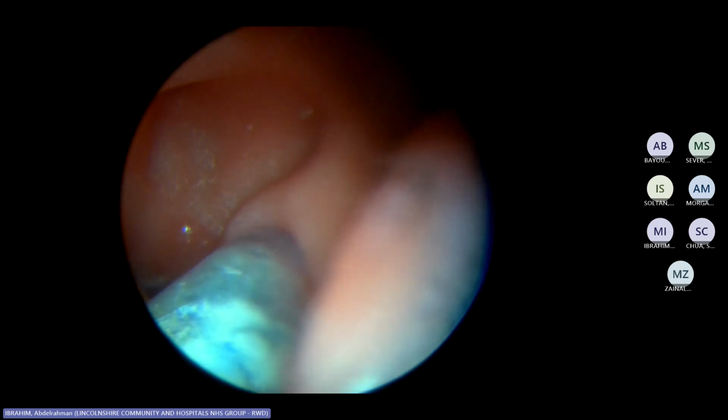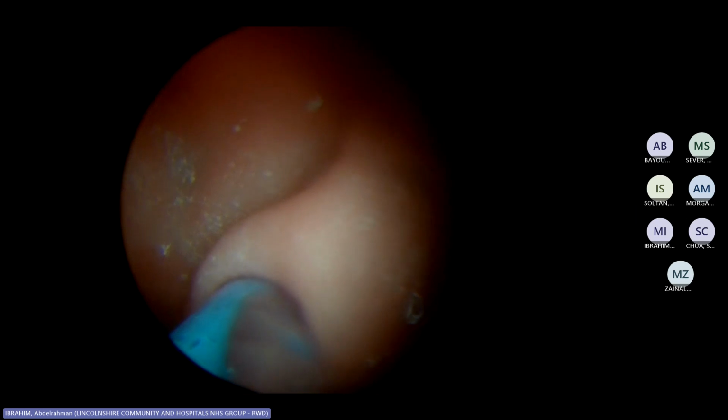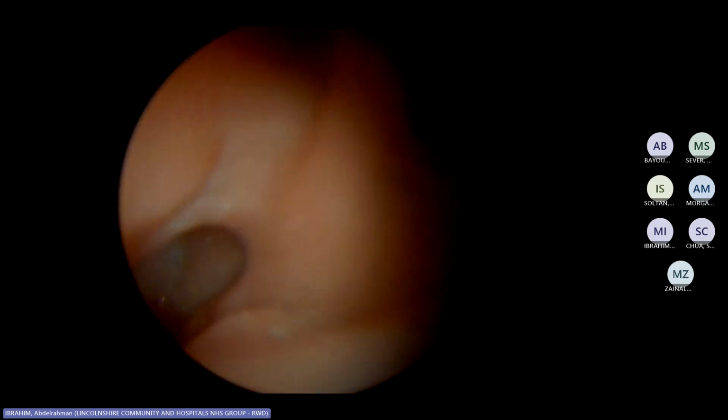Deflate. You can see it now. I'm pushing it for 2 minutes. And you can feel the resistance here as well. You can also see on the camera that the dilatation is happening. Okay, and then deflate. Then again turn around, advance, and then come out.